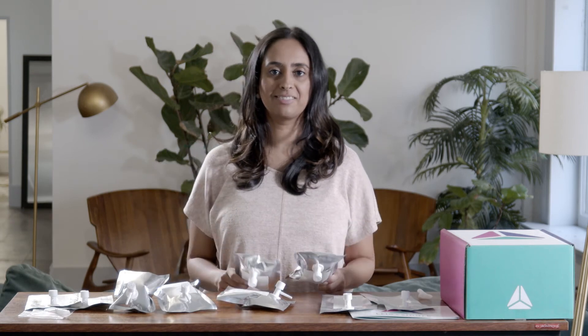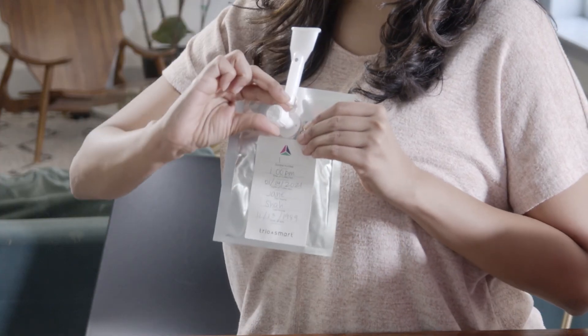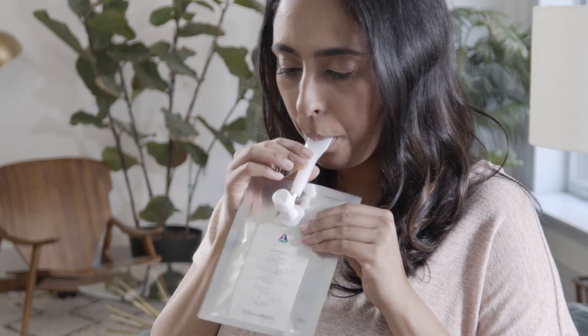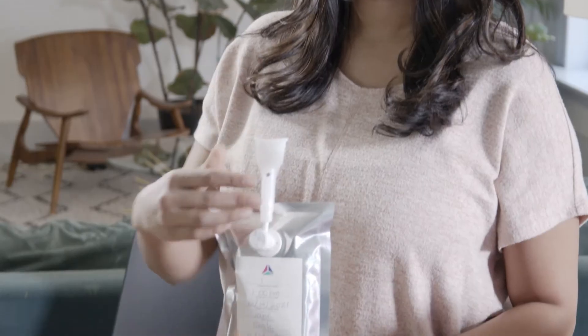Continue collecting the remaining eight breath samples, waiting 15 minutes before each sample collection. For each remaining bag, remember to label it properly. Attach the mouthpiece with the hole facing up and open the valve. Exhale normally into the bag for two seconds and then place your finger over the hole to complete your exhale. When you're finished, remove the mouthpiece and close the valve.